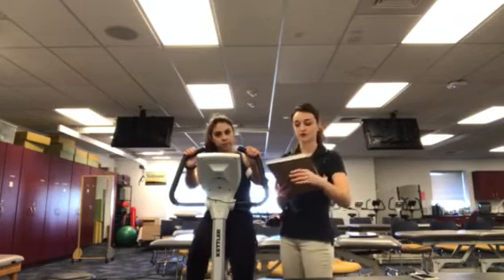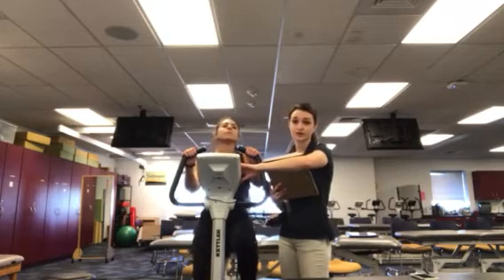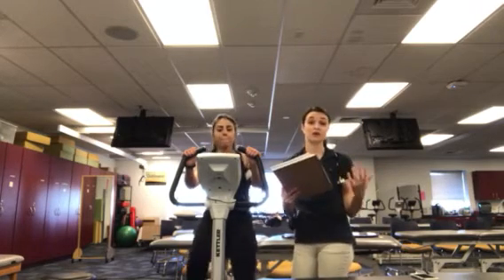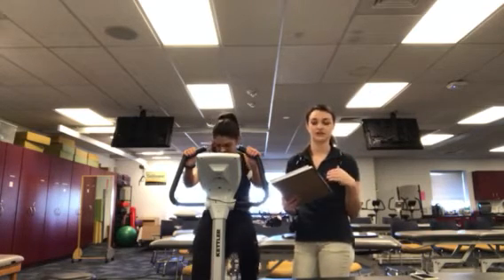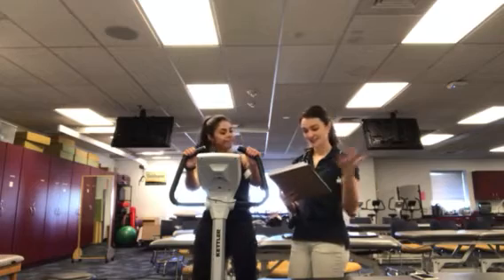Now I'm going to have Brooke cool down. So I'm going to have her cool down for 3 to 5 minutes. I'm also going to bump down her wattage back to that 25. What I want is for Brooke's vitals to get back to around her resting vitals. They should still be a little elevated, but they should decrease, so her heart rate will go down as well as her systolic blood pressure. Feeling good? Yeah. You did great.